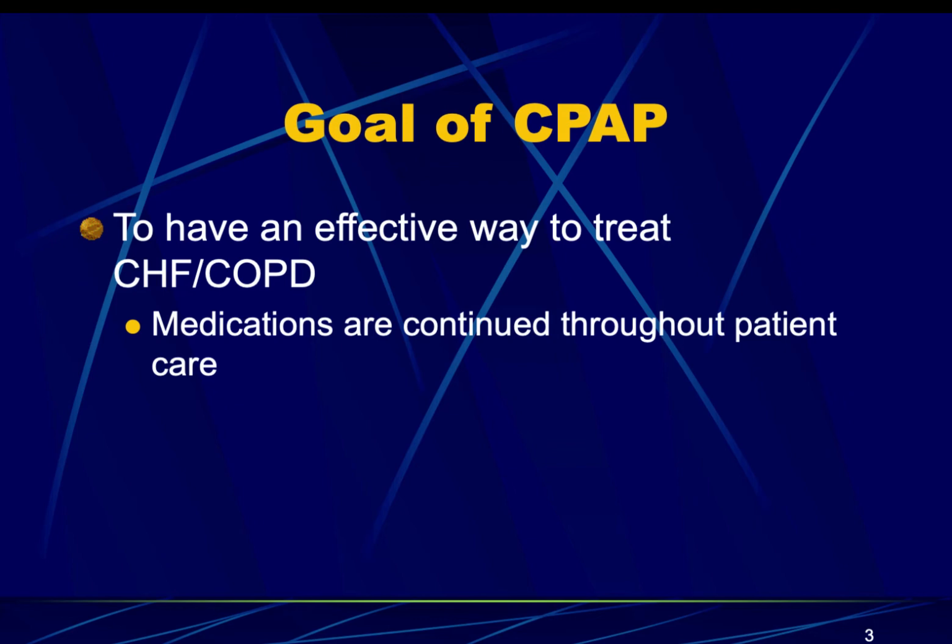Now, CPAP doesn't work by itself. This is a process that you might have to explain to the patient. It can make the patients a little claustrophobic, and this is also something that we use after we have tried to coach the patient's breathing down. However, that has been unsuccessful, and we also have some other clues such as adventitious lung sounds, history of the patient, and any kind of pharmaceutical measures that they may have already taken. Those are all things that we need to consider before we actually start the CPAP.